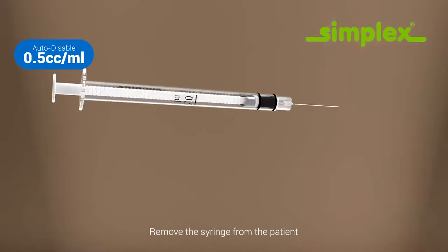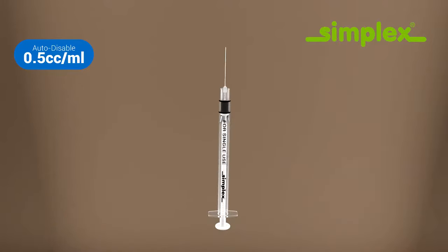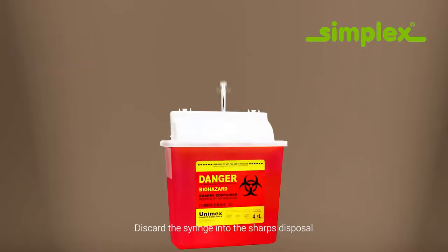Remove the syringe from the patient. Press the plunger completely to activate the locking mechanism and to disable the syringe. Discard the syringe into the sharps disposal.